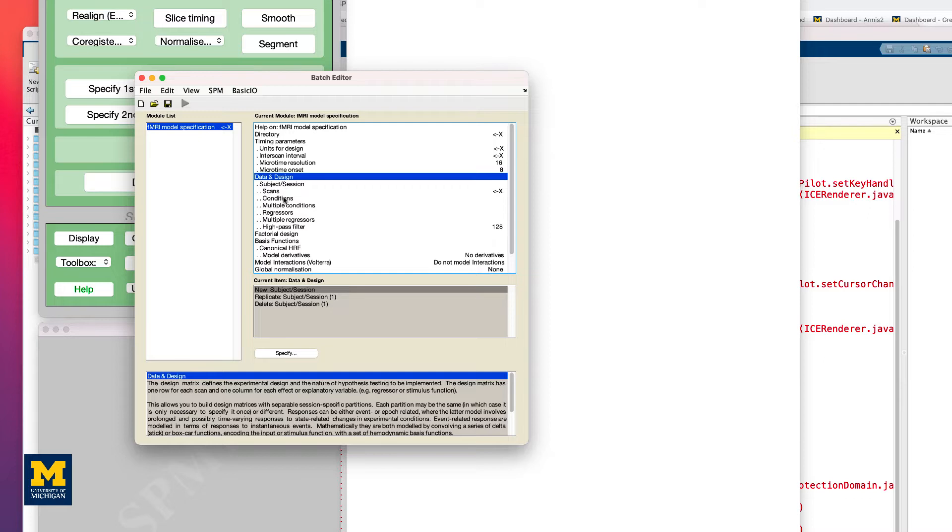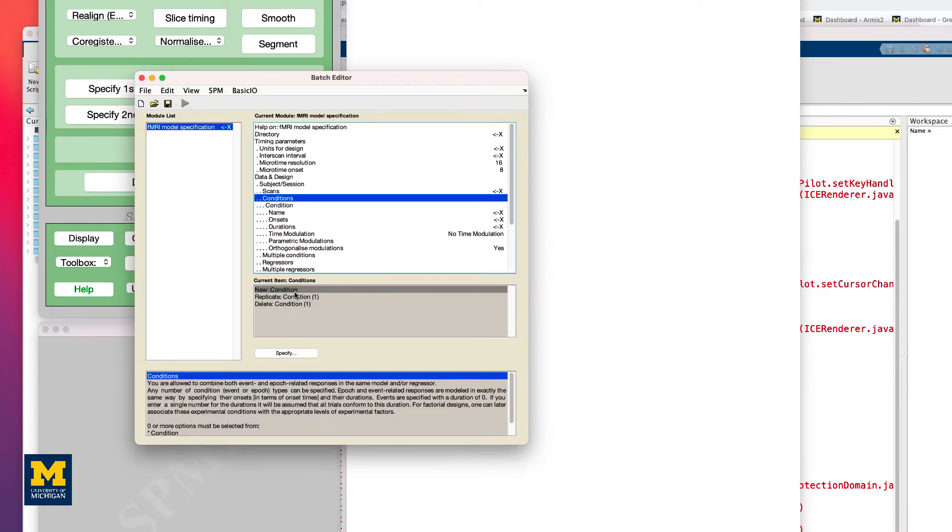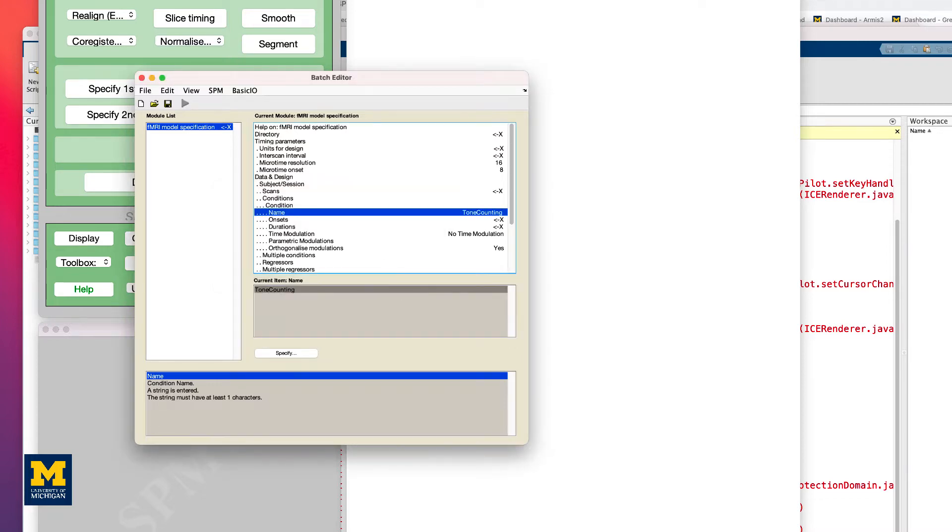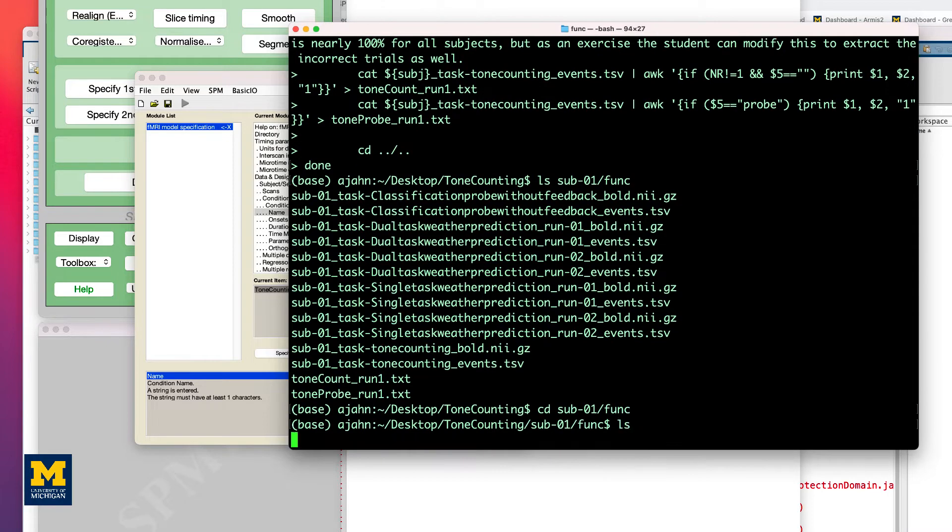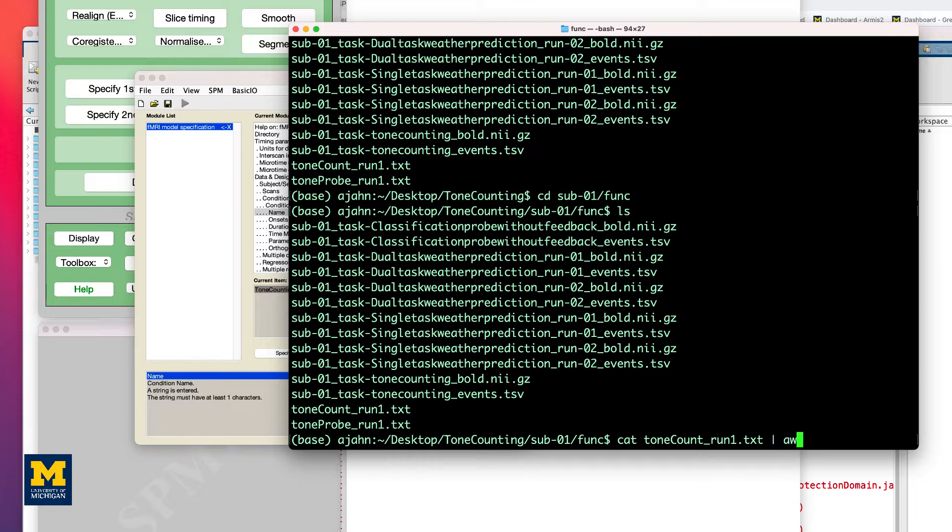Click on New Subject Session, click on Condition, New Condition, and then if we wanted to load the onsets for the tone counting condition, change the name to Tone Counting, and then loading the onsets would involve things like using awk to extract the first column from the Tone Count Onset Times file.